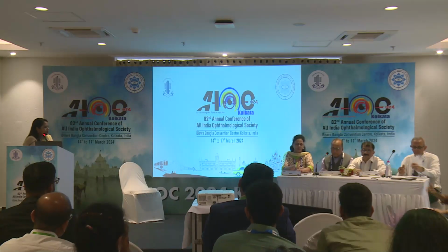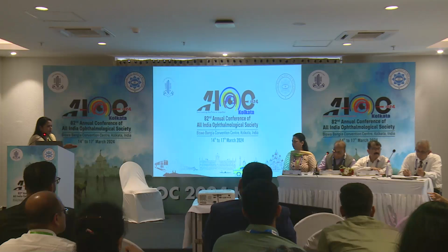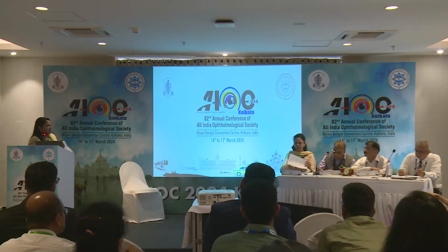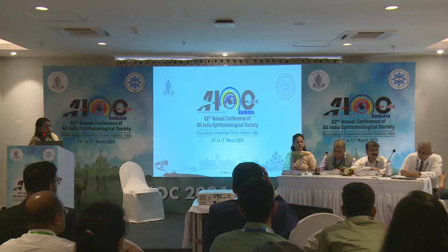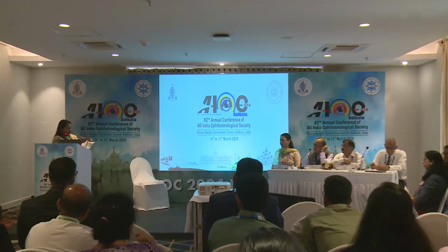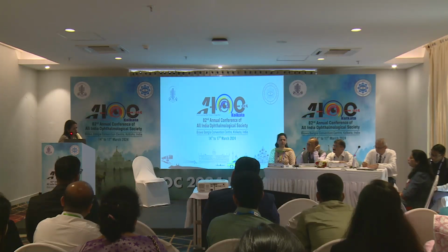Just one question: we are sitting temporarily and doing the laser. Yes, ma'am. Then we have to change the site, ma'am. So the surgeon sits first temporally and does the nasal goniotomy, including the superior and inferior as much as we can. Then the surgeon changes the site, and we change the position of the patient and the microscope also. No, ma'am, no need to stand. We can do it. We just have to change the position of the head of the baby as well as the microscope. It is slightly time taking, but it could be done.